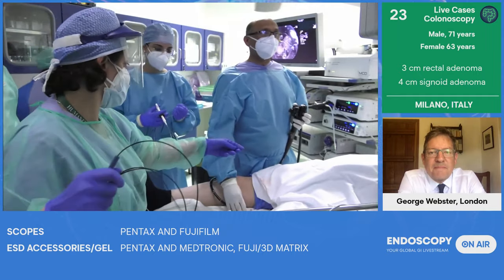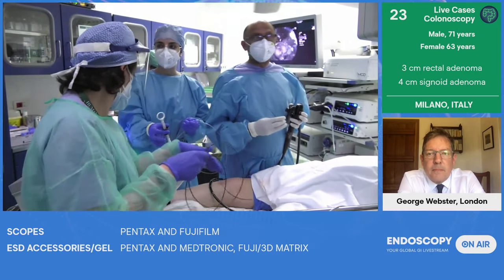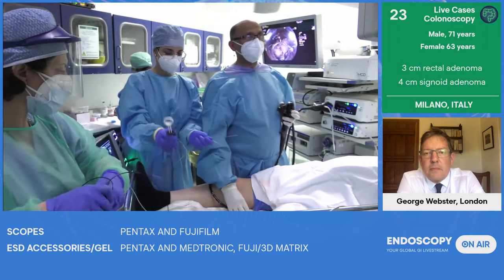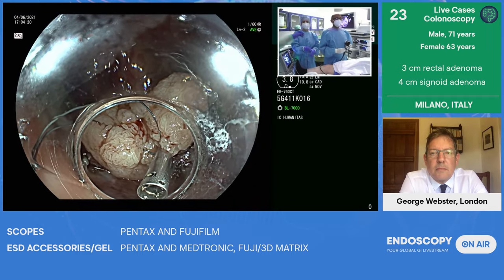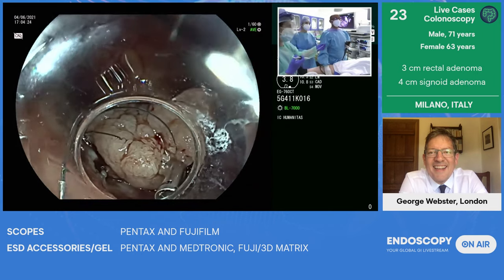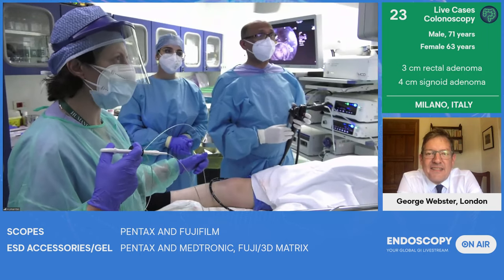Oh, okay. What I've done, George, is use a new traction wire. This is the latest innovation in the world of ESD, and I honestly believe this type of innovation will make everybody, even a person like Dr. George Webster, who only does ERCPs, able to start doing ESD. Because the biggest challenge in ESD is we don't have traction. We can't see our planes.